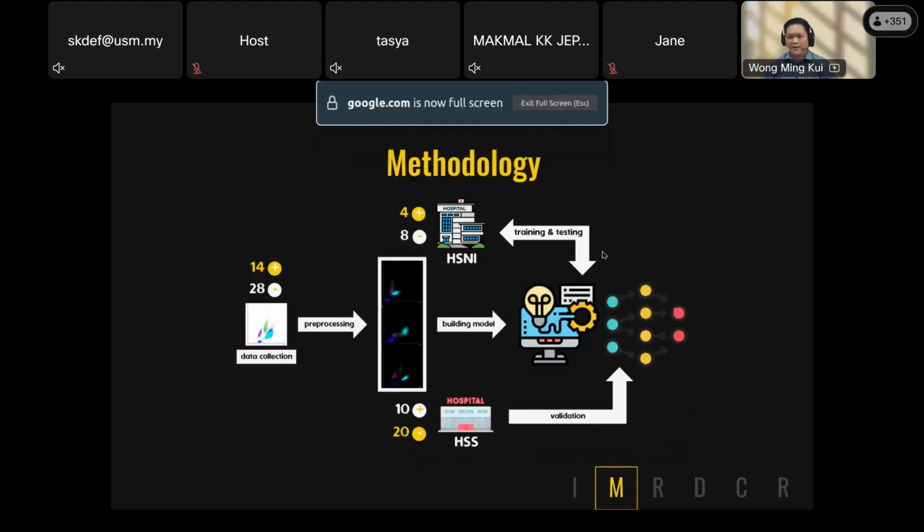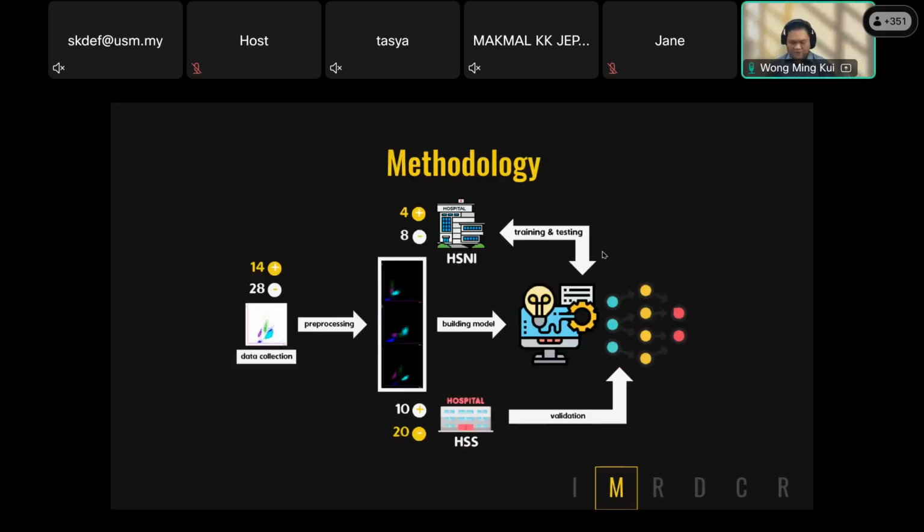For most conventional neural network AI models, they require a lot of data, a lot. Even traditional statistical modeling requires hundreds, like 100 or 200 data. However, machine learning will require much more. We might need 10,000 or even up to 100,000 or millions of data, and this is quite impossible in medical research.